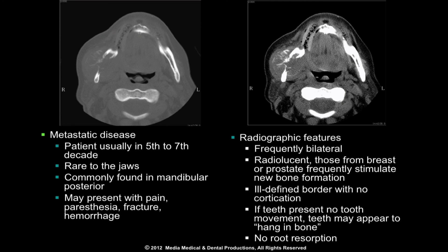In most cases of a known primary lesion, the diagnosis of metastasis is relatively easy. Metastatic disease may be confused with multiple myeloma and primary oral cancer that has invaded bone. However, the borders of multiple myeloma lesions are generally more well-defined and invasion of bone by primary oral cancer can usually be differentiated by clinical examination. In the images shown, note the areas of apparent bone formation within the lesion. This lesion was ultimately diagnosed as metastatic from the prostate.